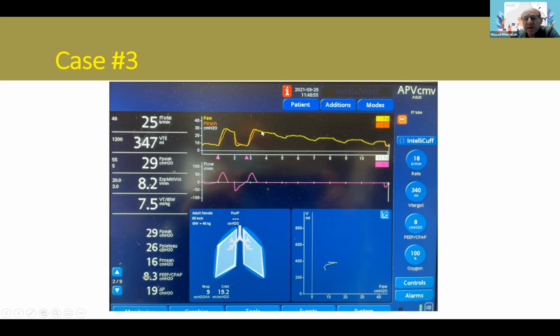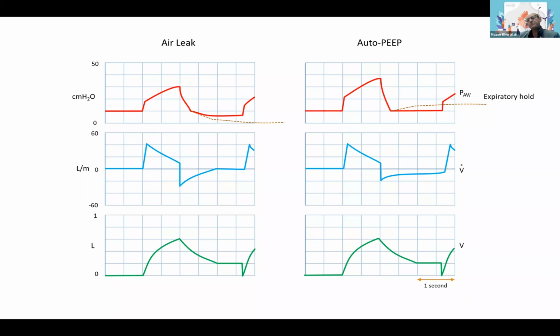And what that caused is a decrease in the inspiratory pressure because you keep losing that air into the pleural space, and the pressure is actually decreased gradually. And the same thing, the amount that he was leaking was probably around 150 every time.